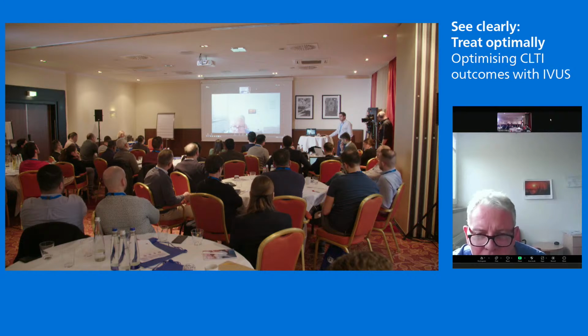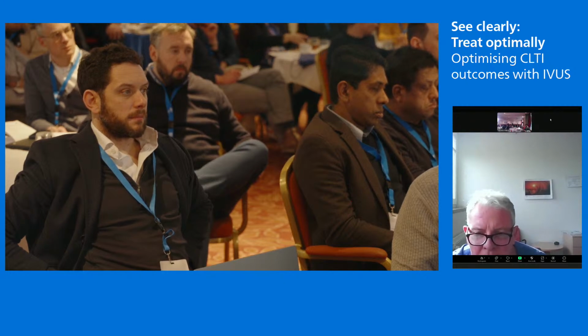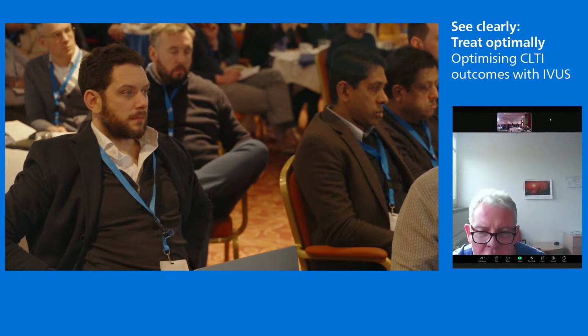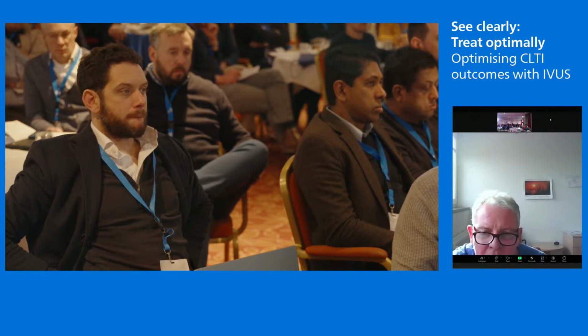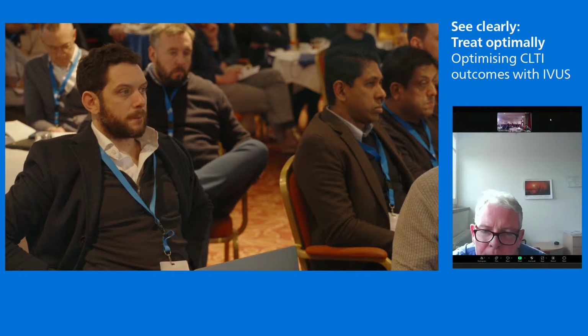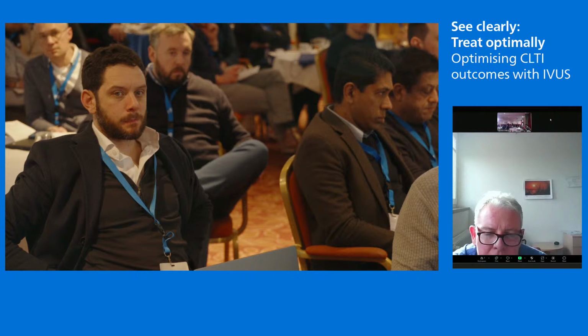And the only device for soft tissue down there is definitely the laser. I can't think of any other treatment. The Stealth is for calcified stuff, maybe can be used down there. The Phoenix neointimal won't do such a good job as with calcified lesions. So the laser definitely below the knee, young diabetic, that's my best treatment option. And then DCB afterwards. Thanks.